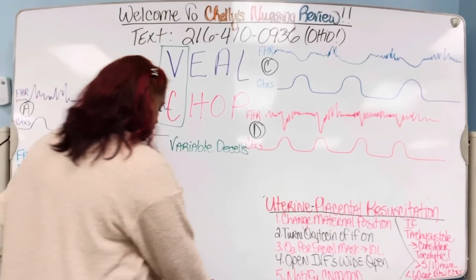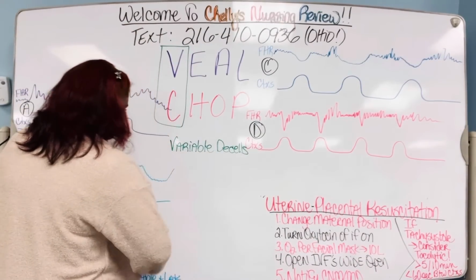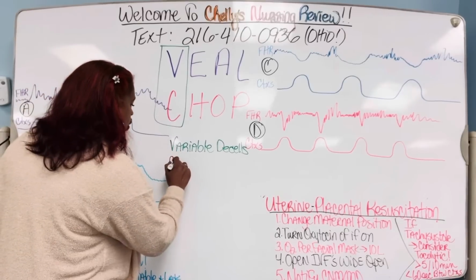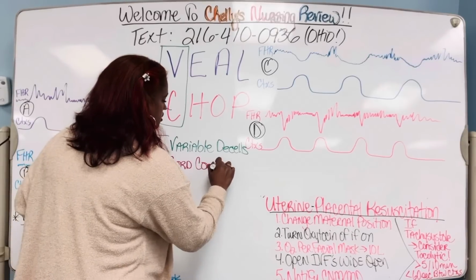Okay, let's take a look at that. Variable decels, cord compression.